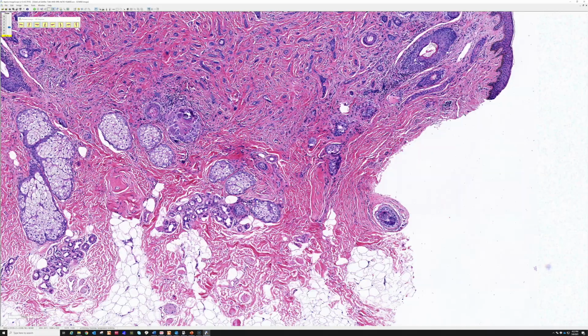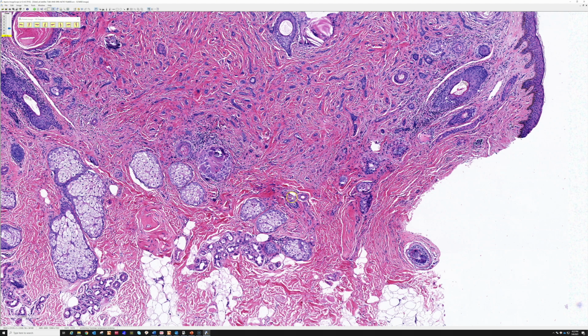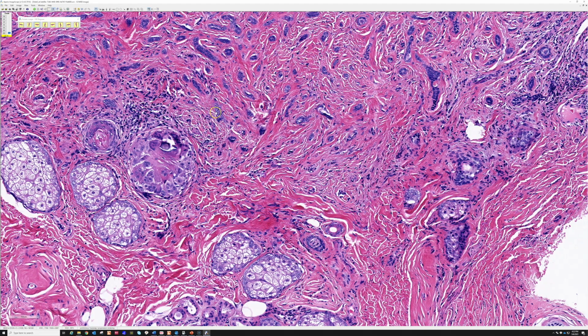I'm going to point out one last thing before moving on to the next case. And this is something that I've changed my views on since I started practice. I was taught, as many people were, that if you see perineural invasion or involvement by a tumor, that supports MAC, not desmoplastic trichoep. But then some members from the Yale DermPath group described that you can have desmoplastic trichoeps with perineural involvement, and that's what we're seeing here. You'll have to believe me, I can't go any closer, but that is actually a tiny little nerve, and it's wrapped around by those benign-looking, bland, blue basaloid cells.